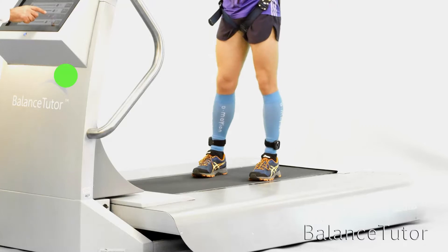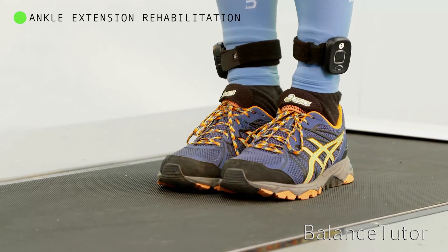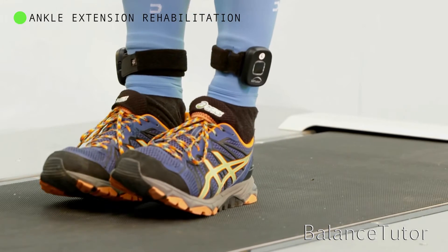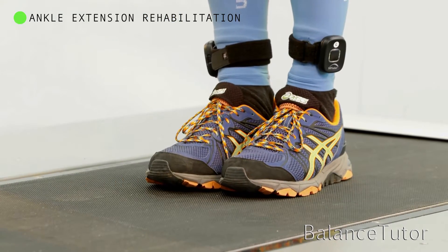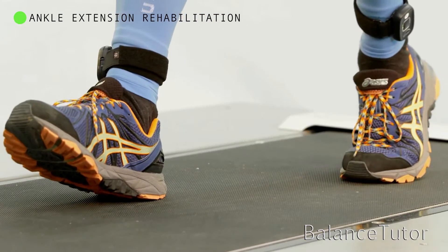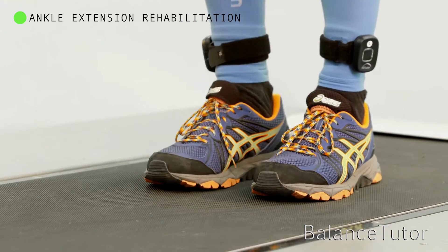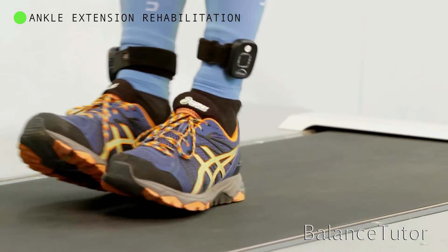Here is a specific treatment for ankle extension rehabilitation. By moving the platform from a backward to forward direction, the ankle is forced to react automatically to the perturbation by extensor muscles activation.